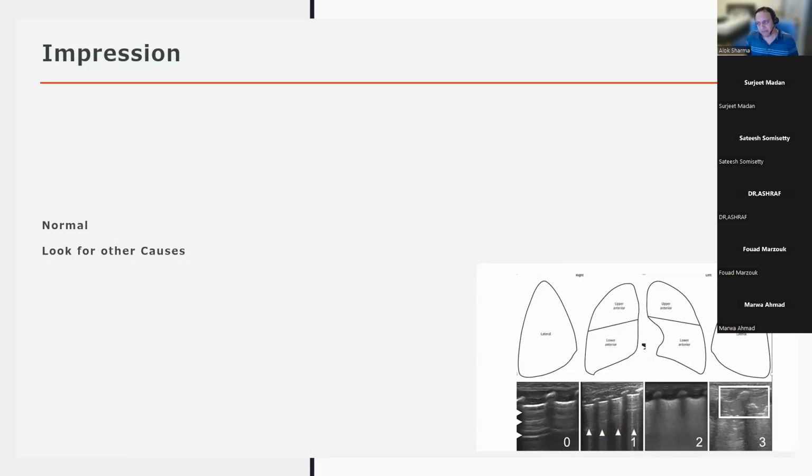So the one thing that I think Dr. Ashraf is right about is that if you have a baby who's not saturating and you have significant RDS, the posterior zones might need more recruitment and atelectasis. Towards the end of the course, we'll be talking about patterns that help guide you with lung recruitment on the ventilator. What's been described in the literature is classically the S pattern. Any questions about today?